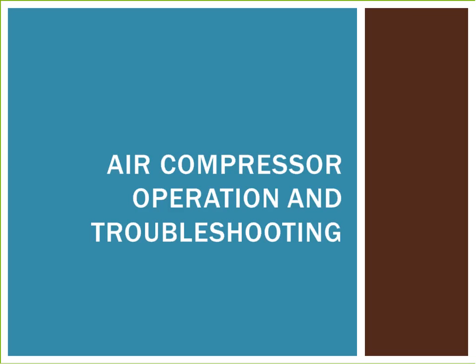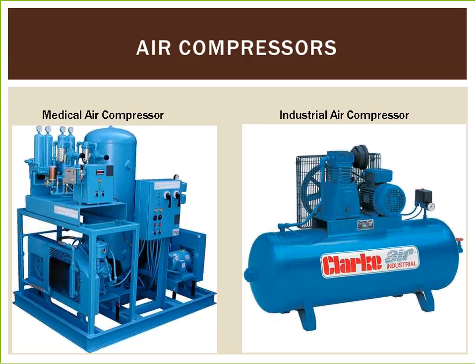Next, we will be covering air compressor operation and troubleshooting. In a hospital environment, there are two types of air compressors. Medical air compressors provide a high-pressure air source for medical operations and procedures and come in direct contact with patients. They provide extremely high filtration and moisture removal. They also ensure that the air supply is free of any bacterial or infectious materials or organisms.